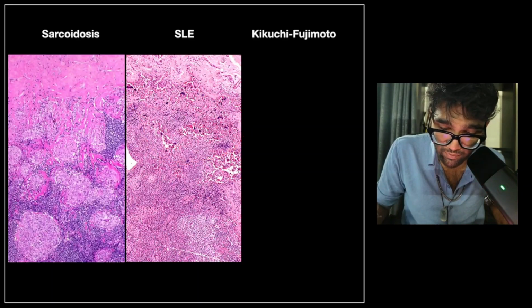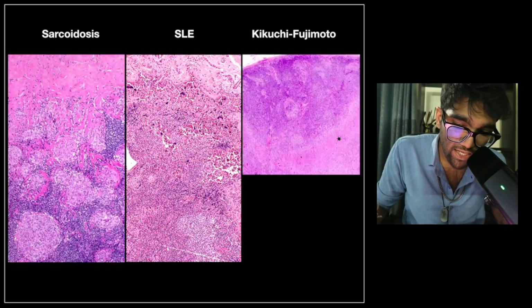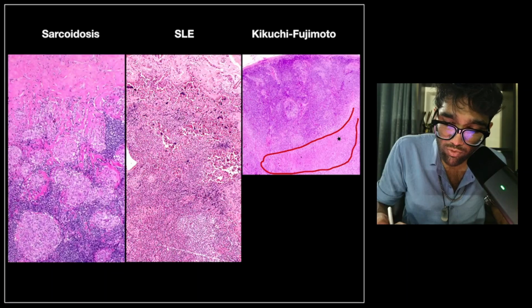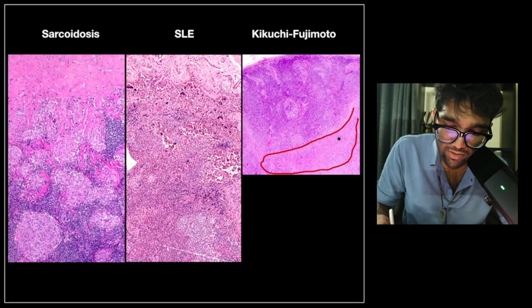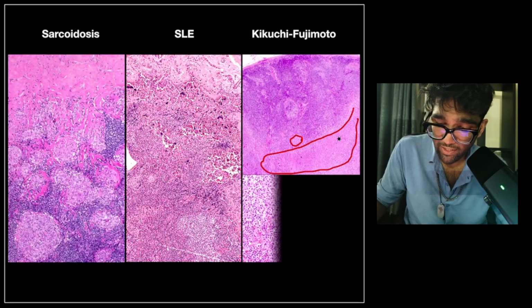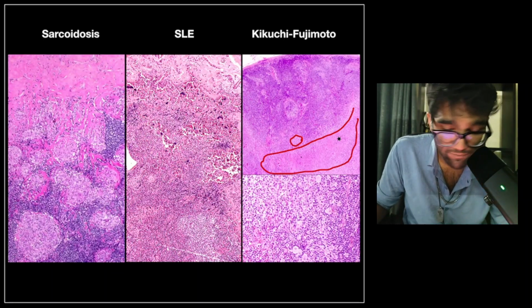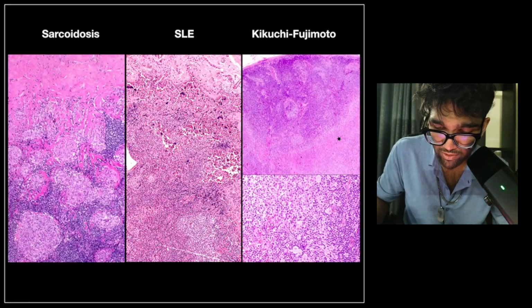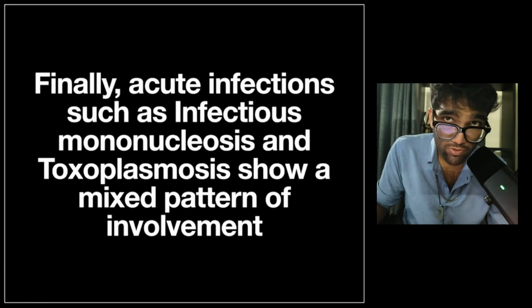And finally, we see another lymph node here, which has a confluent eosinophilic area, which is actually necrosis, surrounding which we've got some areas of histiocyte infiltration and then some normal lymph node. Again, in higher fields, we find infiltration with these histiocyte-like cells, which happen to be plasmacytoid dendritic cells. I've not shown the immunohistochemistry here. So that was Kikuchi-Fujimoto.